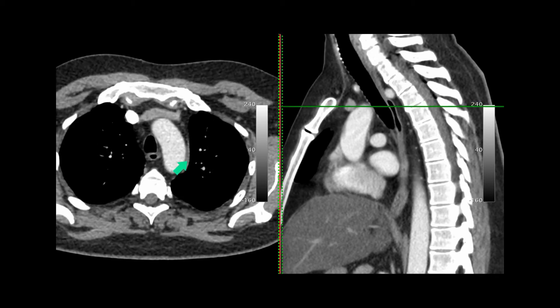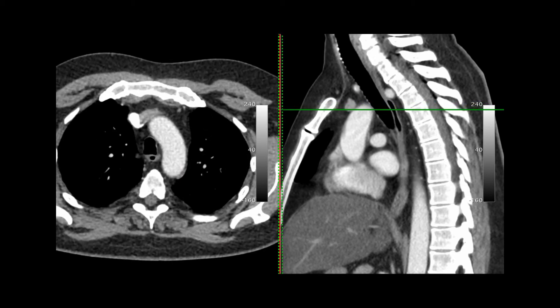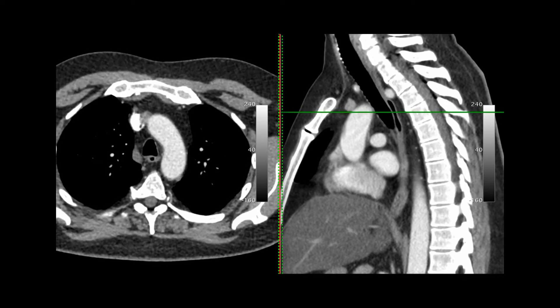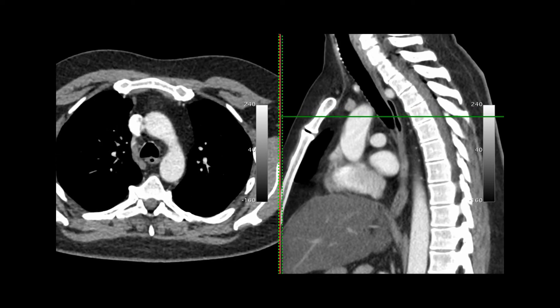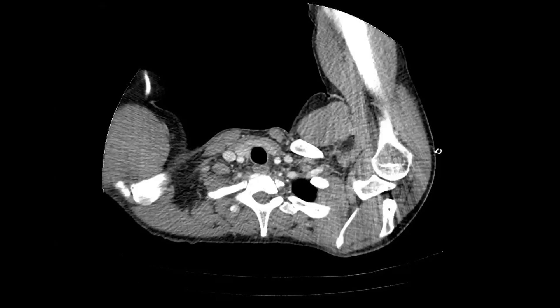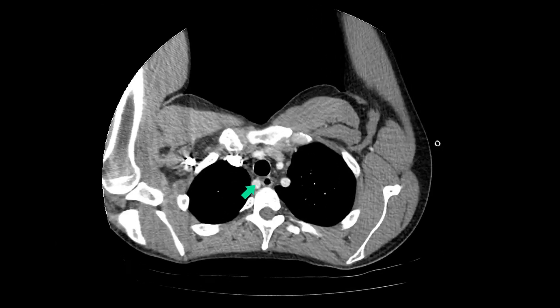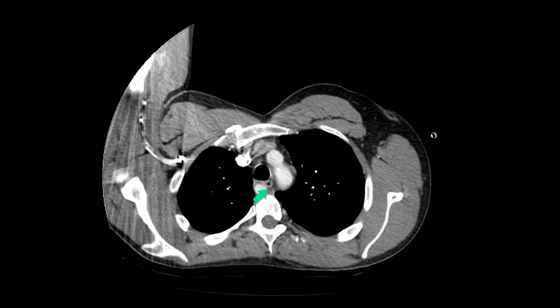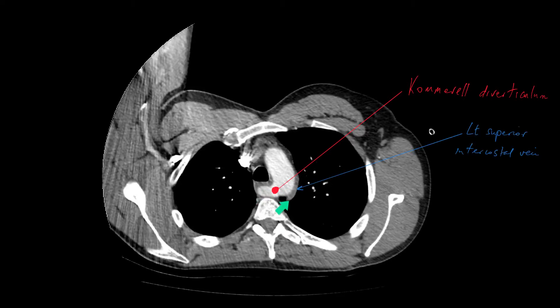Here is the left superior intercostal vein. Here is another patient who has an aberrant right subclavian artery seen going behind the esophagus. Here's Kommerell's diverticulum. And here is the left superior intercostal vein.